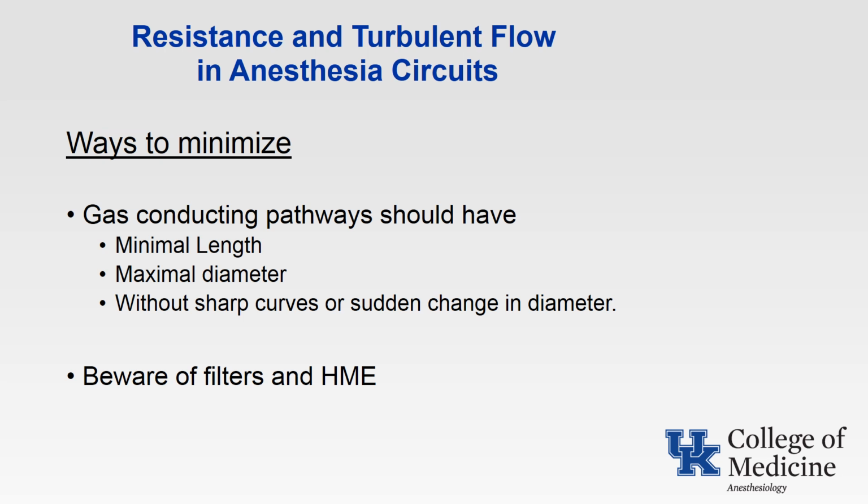These include minimizing the length of the conducting pathway, maximizing diameter, and avoiding sharp curves and sudden change in diameter. And beware of filters and HMEs.